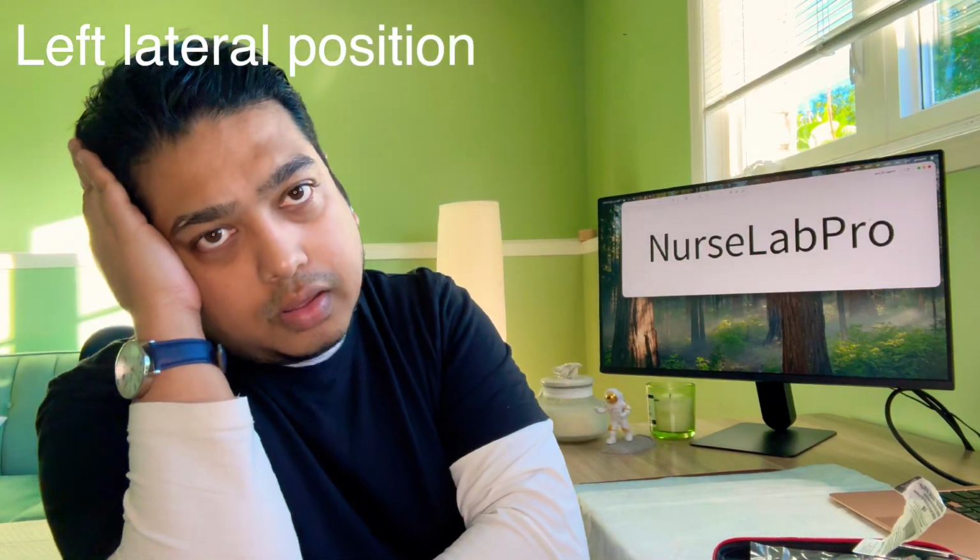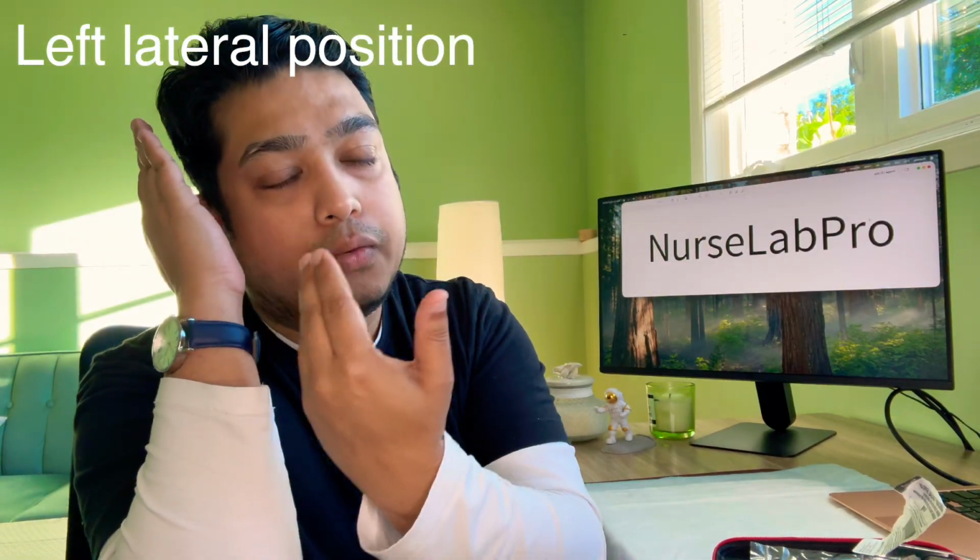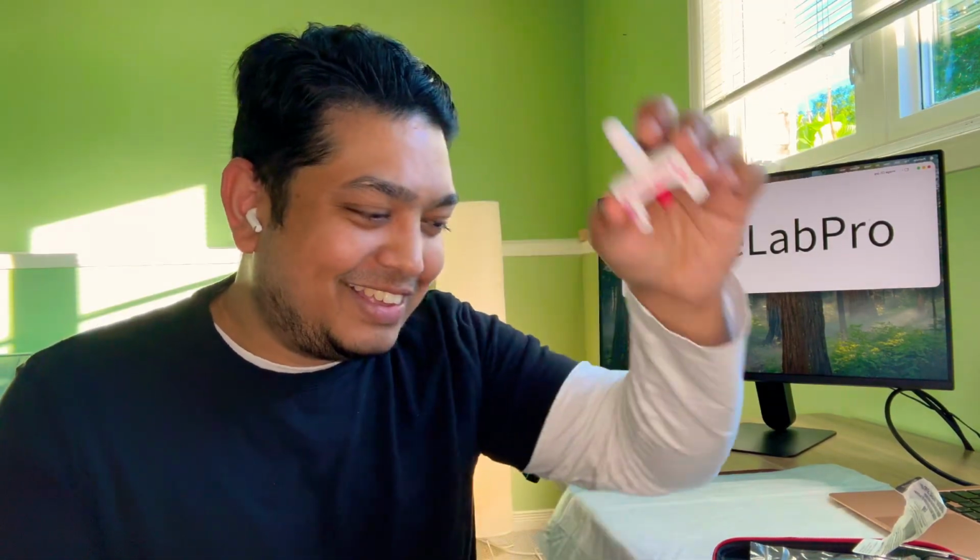So when I do the first dose, I put the patient in the recovery position, which is a side-lying position with the arms below to support their head and their body. That's how we help the patient when there is opioid toxicity with the help of a magic drug called Narcan.